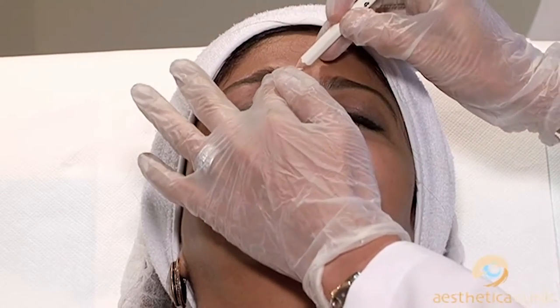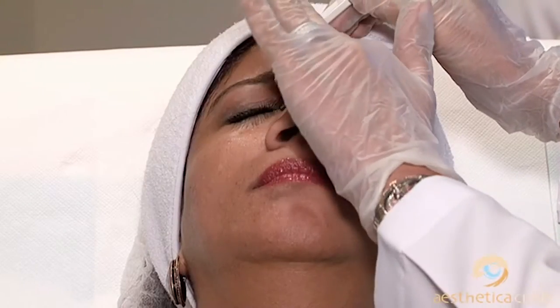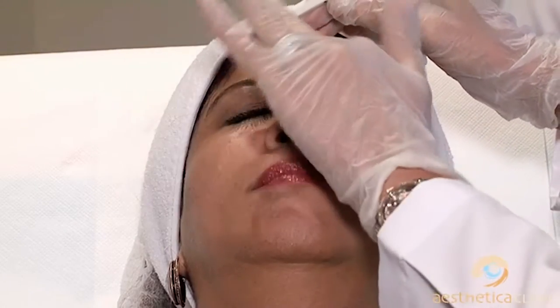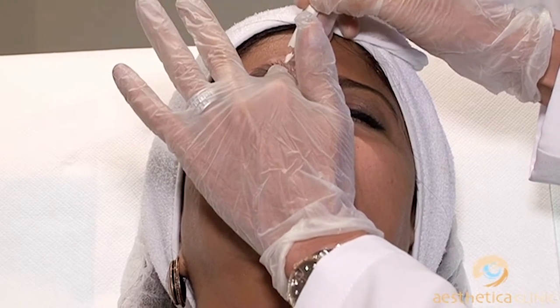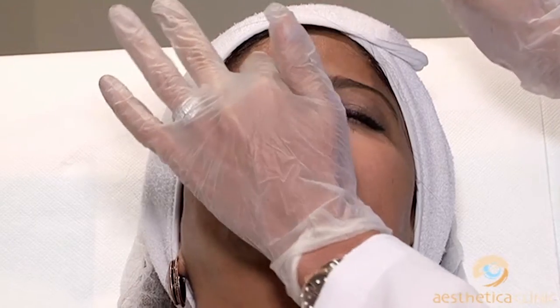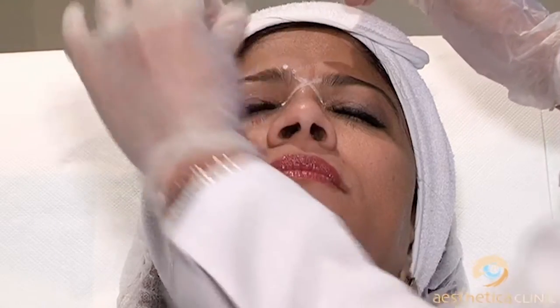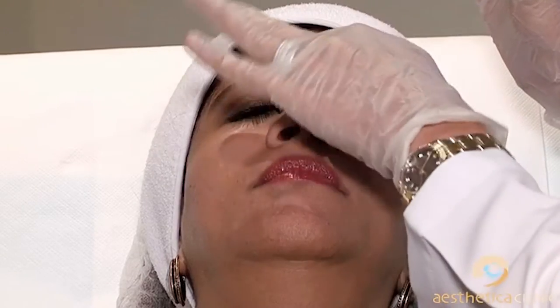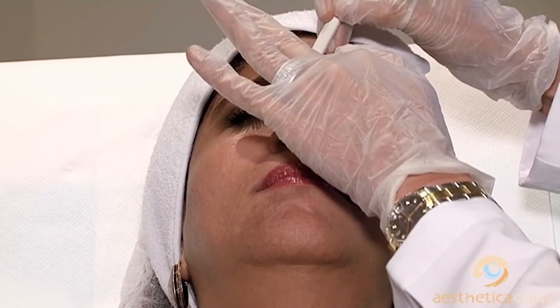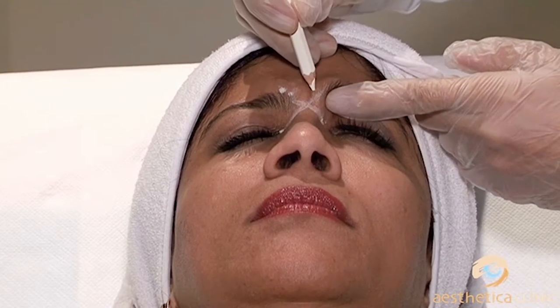For the corrugators, we go one centimeter above the orbital rim and we do two points, and those two points we do rather medially. You have a lot of publications that show points going all the way, but if you're not an experienced injector, don't do that. Stay in the medial plane and rely on diffusion of the toxin, because every point you inject will diffuse about half a centimeter around, so you will still be able to get those fibers.